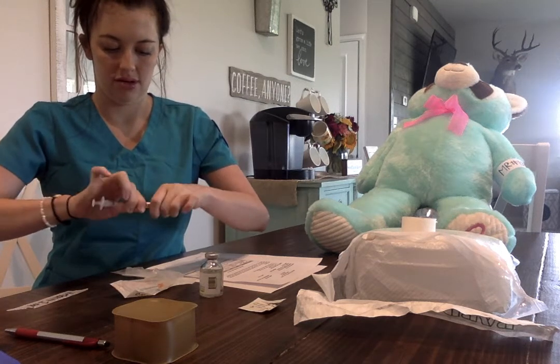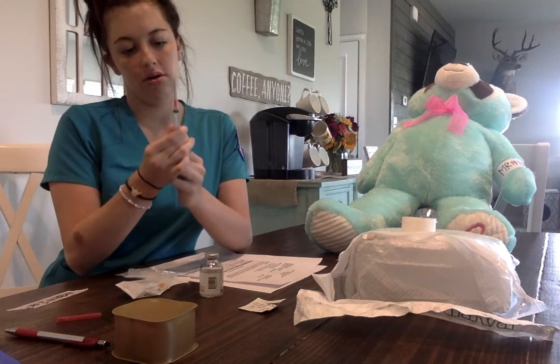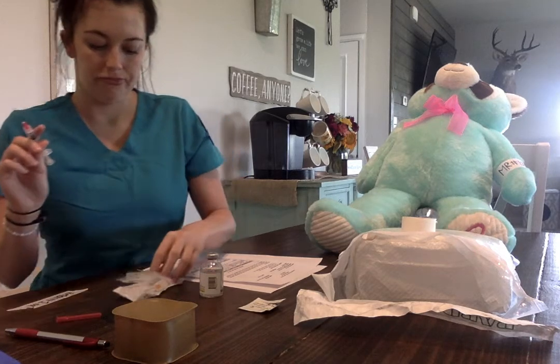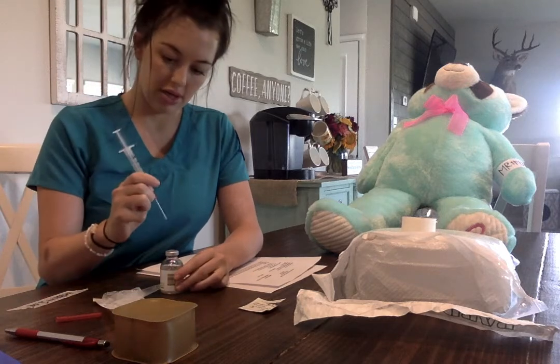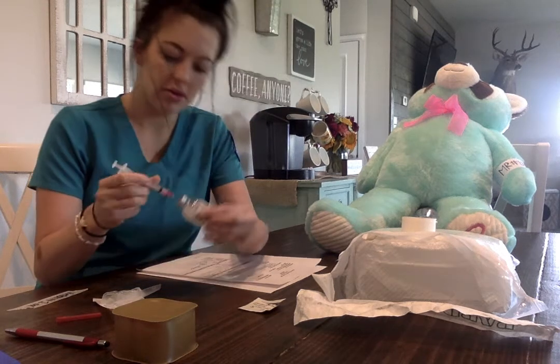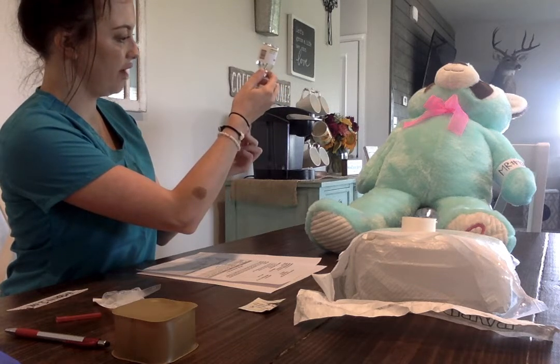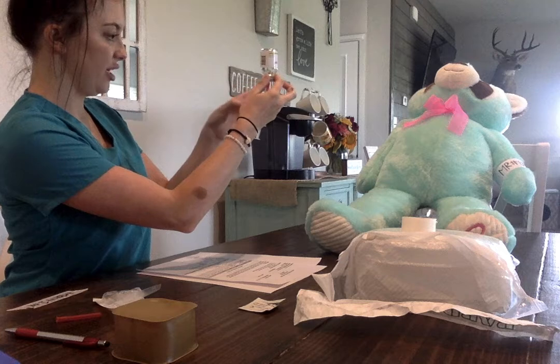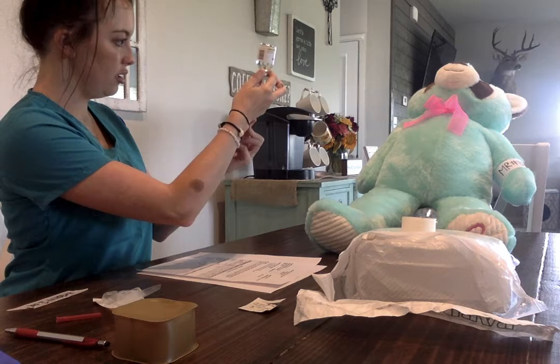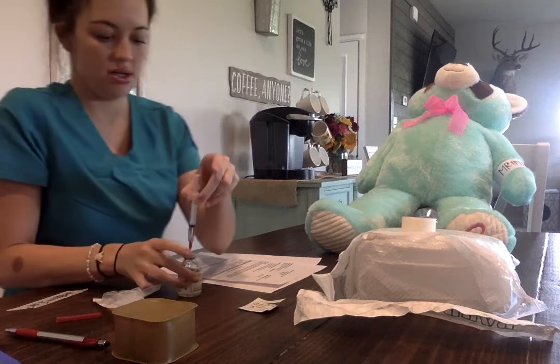Drive in a little bit, get 1 ml right there. Alrighty, that has dried, so I'm going to go ahead and inject air to air, turn over and draw out 1 ml of heparin. And I'm going to flick out any air bubbles that are in there. Okay, that looks good.